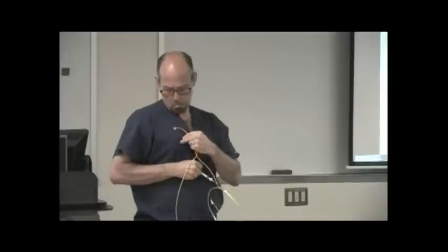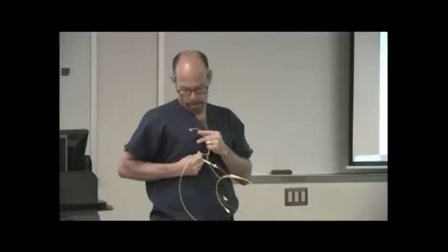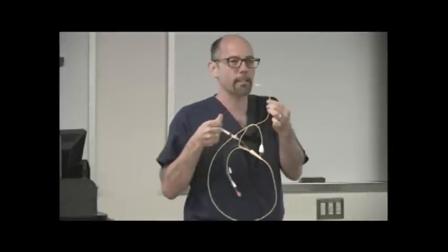When I inflate this balloon, I want you to notice what happens there. I can still see the tip of that balloon. So in the pulmonary artery, if I inflate the balloon and occlude the pulmonary artery, the distal tip is still looking forward into the pulmonary circulation. All right? It's called wedging the catheter. We don't do that anymore much at all. But if I do this, I can look through the pulmonary vasculature all the way through to the pressures of the left atrium. So with this catheter, I can indirectly monitor left atrial preload. All right, that was the goal of inventing this catheter.